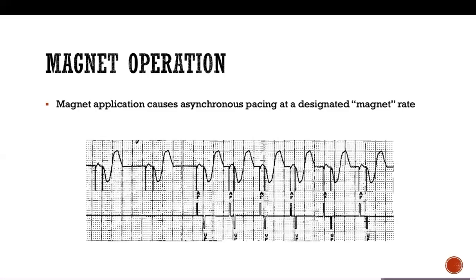So if you're during the night, you need to take him to urgent surgery. You don't have the facility of getting the programmer and analyzing the pacemaker and changing the pacing mode. The easiest and quickest thing is to put a magnet on the pacemaker. Any magnet would do. It doesn't have to be the company specific magnet. So any magnet would do.